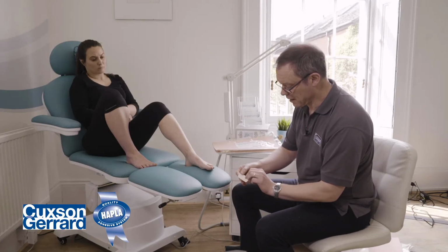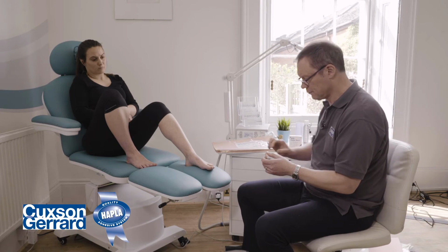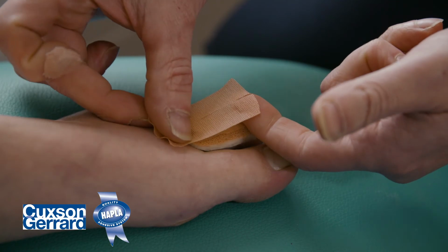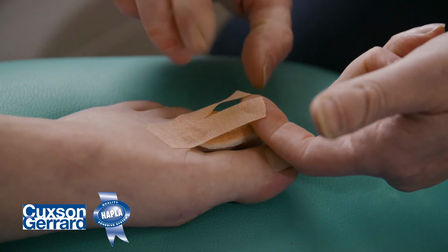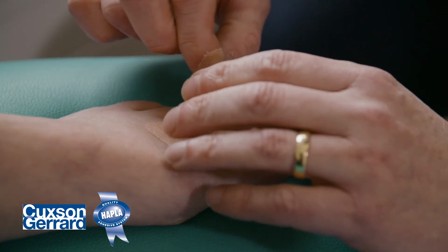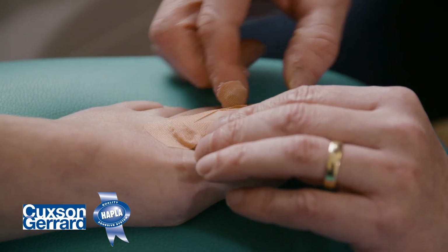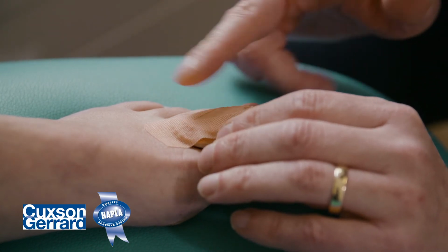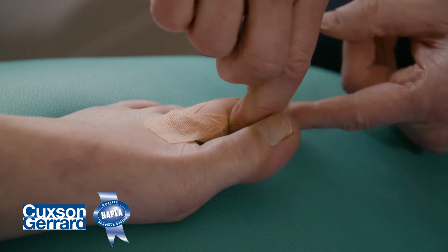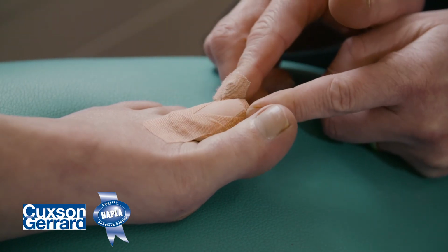So now peeling the paper back off the Hapla band. Just lay it down over the top of the pad with the skin then receiving a major portion of the tape over the pad itself. Taking the lateral portion, just put a gentle stretch on it and then curl it round the lateral portion of the toe and over the portion of the pad. So that's the lateral side secure, and then with the medial side, just lift that slightly, and then just lay this down under a light stretch on that medial side as well, just to secure it down.